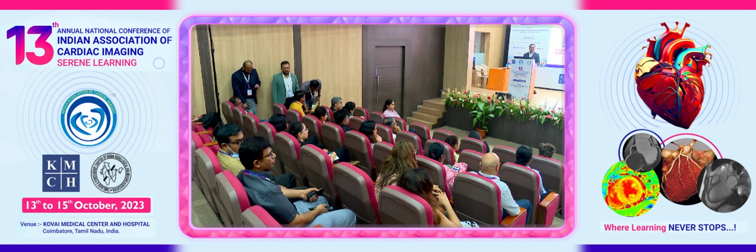Yes, we should. When we're talking about regurgitation, there's a lot of PVR, pulmonary valve regurgitation, that we're now looking at, because these are all the children with TOF who were operated back in the 90s. Now we have them all coming with RV dilatation and PVRs. So we really need to understand it, have a very good delineation of it, and know how to image it well. Thank you so much. Thanks, Sandeep. Great talk.